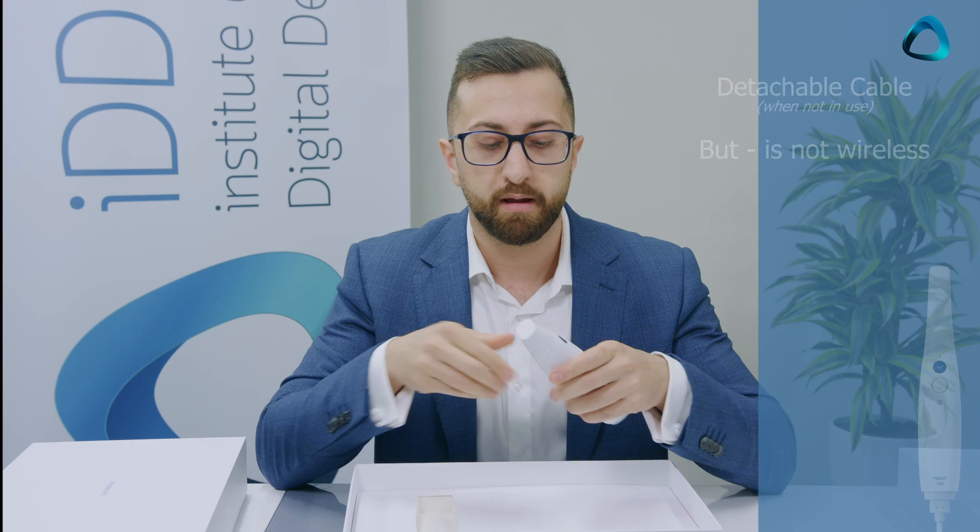Another thing you'll instantly notice is there's no cord here — the cord for the Medit i700 is completely detachable. Compared to the i500, the casing is no longer a rubber material; it's a plastic material. Overall, just a really good-looking scanner. That's the Medit i700.